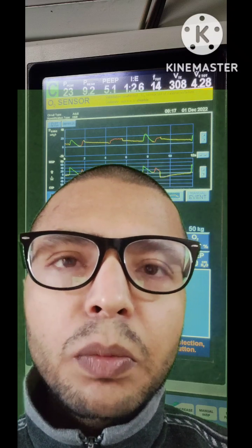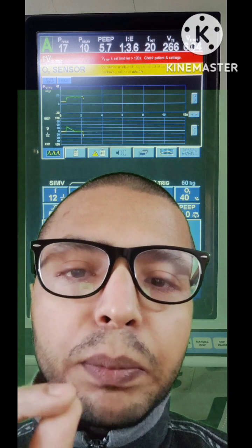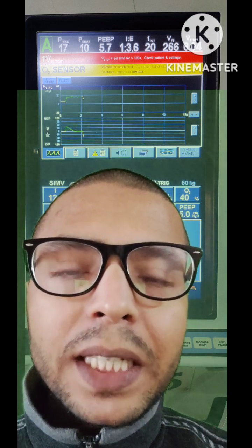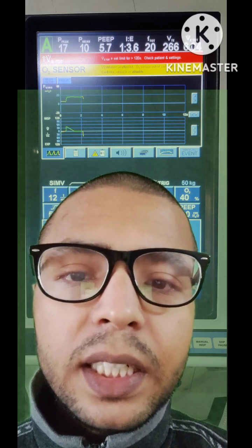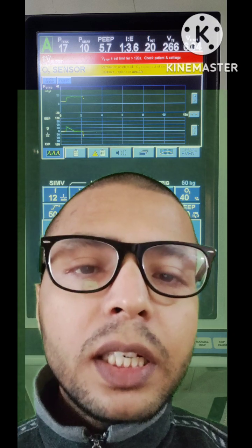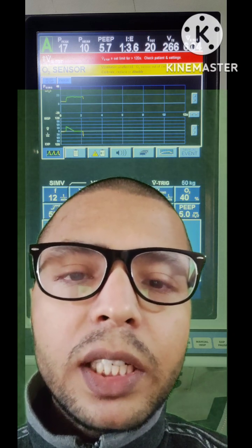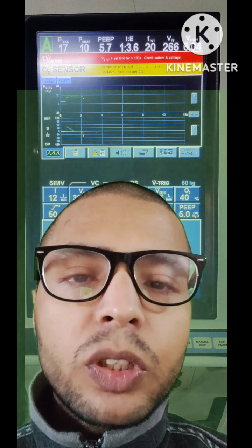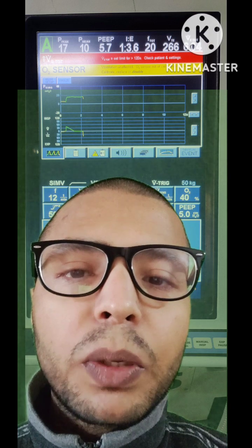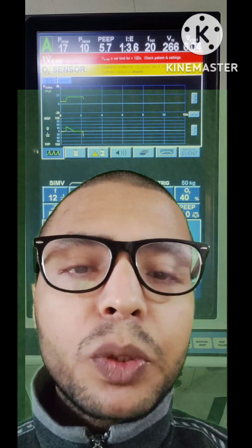You might have seen some conditions where, when you use a pulse oximeter in the peripheral limbs, it shows a low reading, but the patient may not have such respiratory symptoms or respiratory distress, so it may be a falsely low saturation. So what are the conditions where you get falsely low SpO2 from the peripheral limbs? In patients with connective tissue disease, with Raynaud phenomenon, where there is vasoconstriction in the peripheral limbs, what happens?